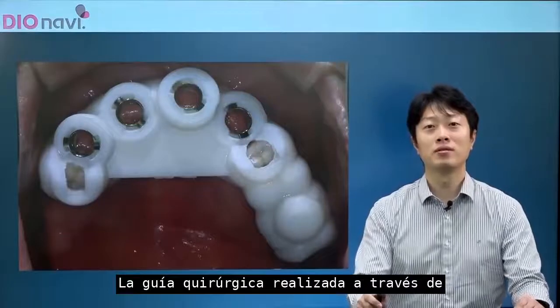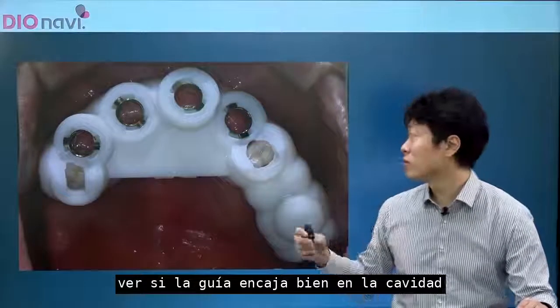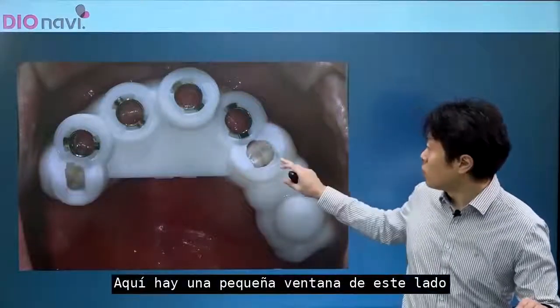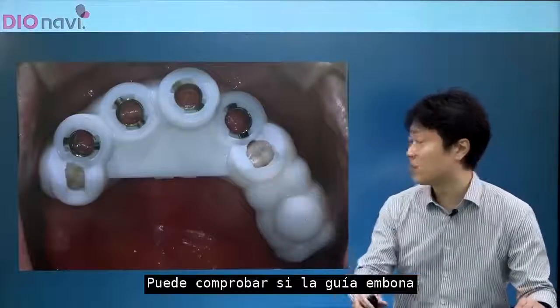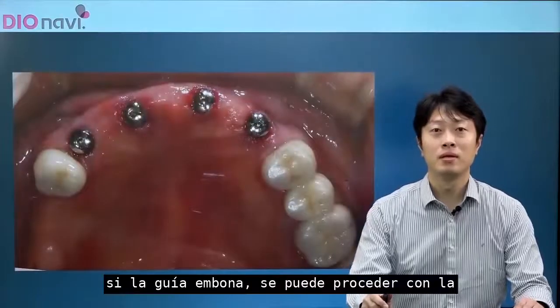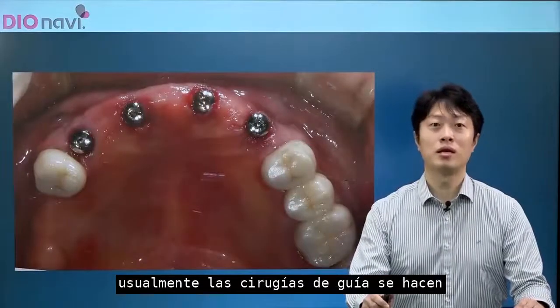The surgical guide made through this process is sent to the clinic to see if the guide fits well in the patient's oral cavity. Here is a small window on this side. Through this window, you can check whether the guide fits well on the teeth. If the guide fits well, you can proceed with the surgery according to the surgical protocol.